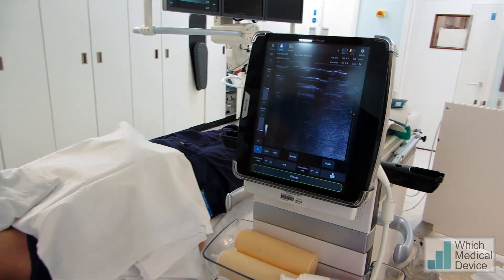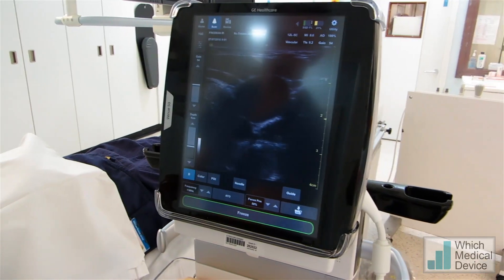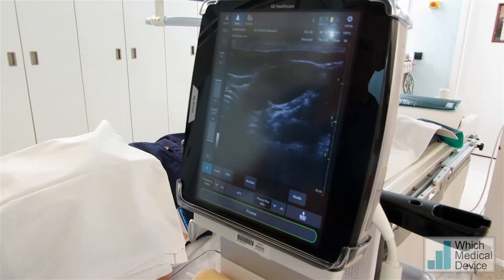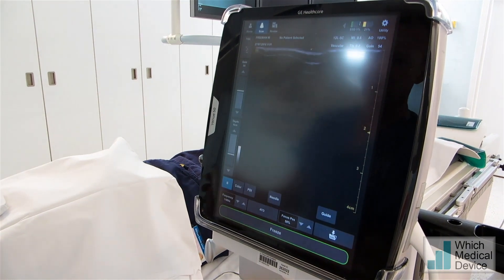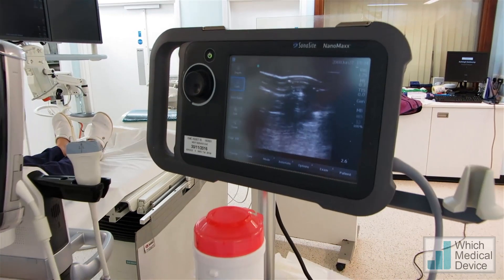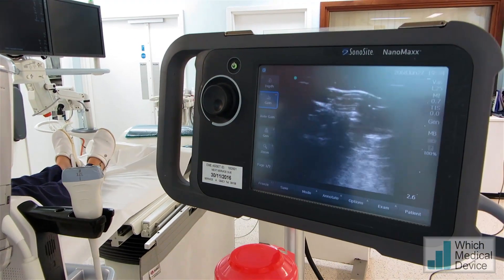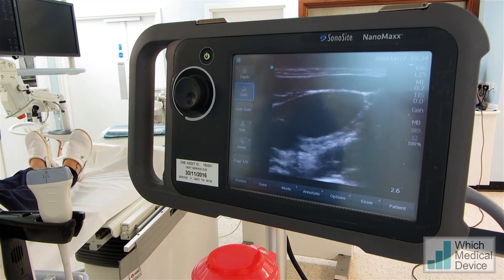Just going to the GE Healthcare. Not a bad image, but considerably larger machine of course. Now we'll go over to the SonaSight NanoMax. This is probably an older machine and the image isn't quite so good.